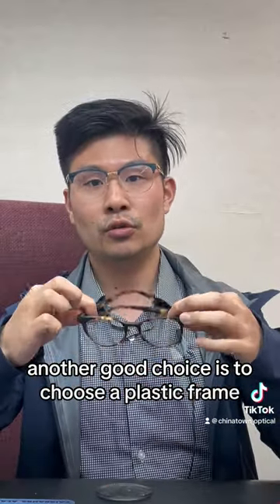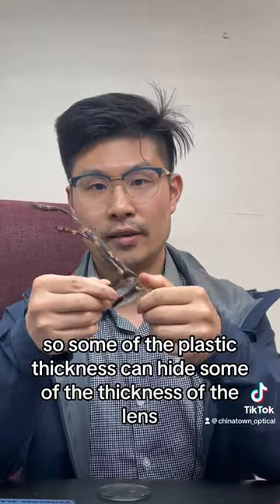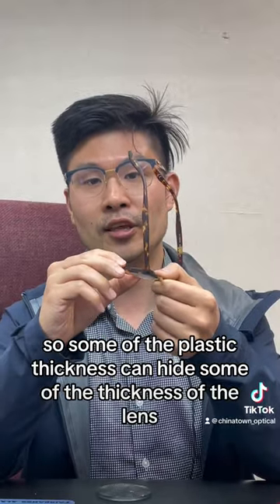Another good choice is to choose a plastic frame, so some of the plastic thickness can hide some of the thickness of the lens.